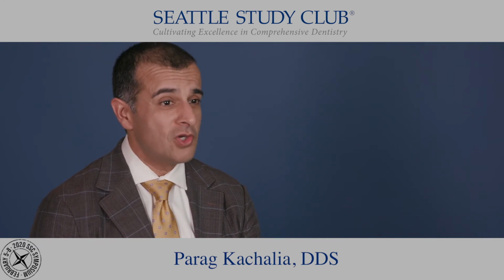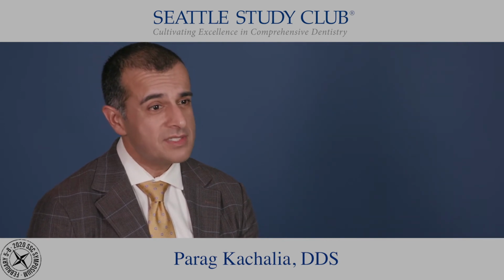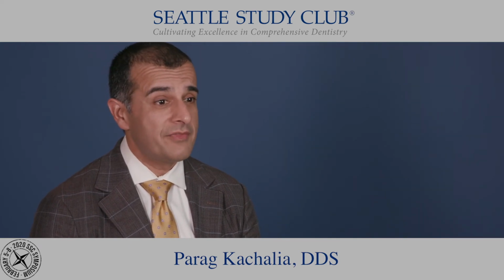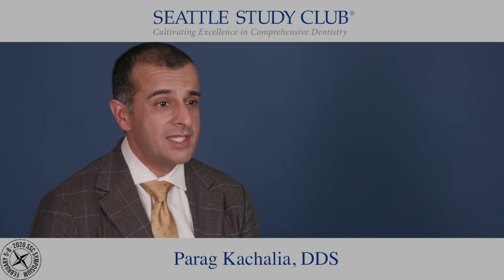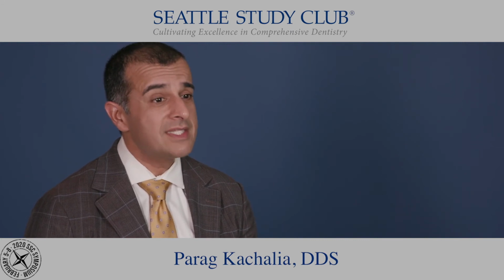I don't necessarily take a cone beam CBCT on every single patient that walks in, but I do it when it's appropriate, to look at that next dimension of care for our patients, whether it's airway analysis, or whether there's an area where they had root canal therapy and it's not healing, and it may be many years after the fact. Rather than going back and forth or taking many different periapical x-rays, I take a cone beam image of that area to figure out what's going on. That doesn't mean that I go in and treat it, but I help on the diagnostic factors.